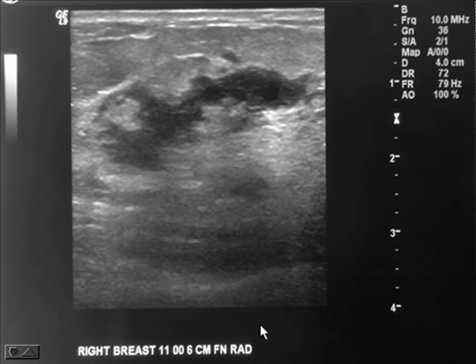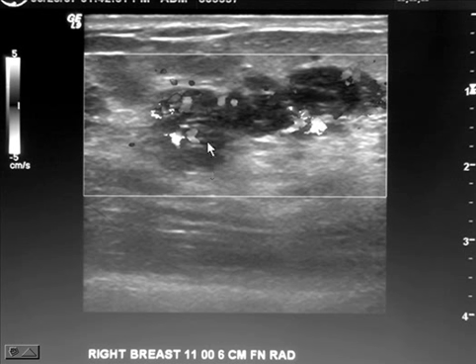But the ultrasound shows us that this is definitely a very abnormal looking area that looks very different than the surrounding tissue. Hypoechoic, irregular. Doppler shows vascular flow within this mass. Now, using the ultrasound characteristics of benign versus malignant, you would put this in the malignant category because it does not have sharply circumscribed margins. But nothing comes in a vacuum. You have to consider this along with the entire clinical picture.